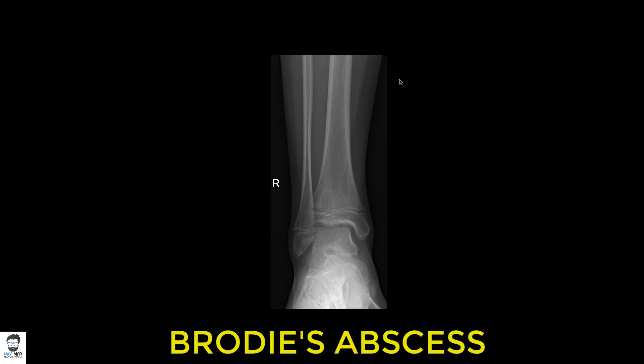Welcome to another lecture. Today we're going to look at an interesting condition found in children. This is an x-ray of the right ankle. You can see the fibula bone, the tibia bone, the ankle joint, and the talus bone. For more information on how to read an ankle x-ray, click the link above.